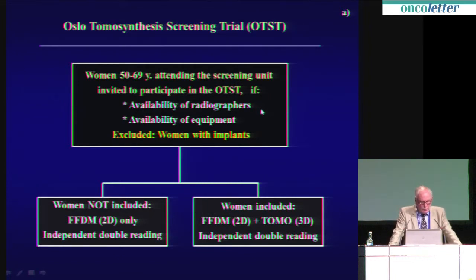So what was our intention with the Oslo Tomo trial? All women attending the screening unit were invited to participate in the study. We excluded women with implants, and we excluded women with pacemakers.